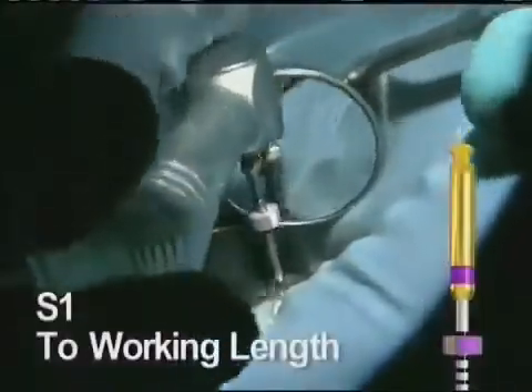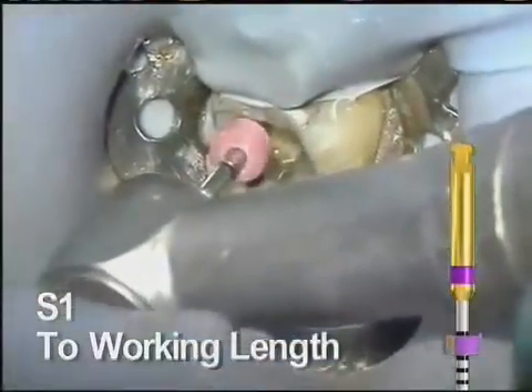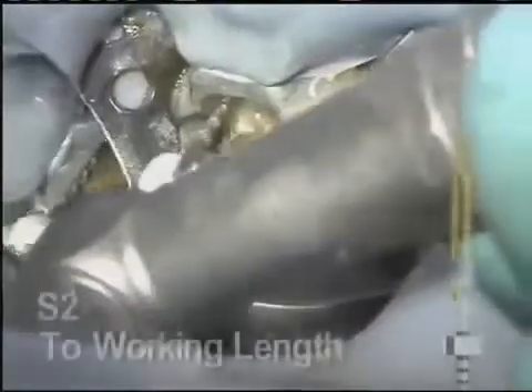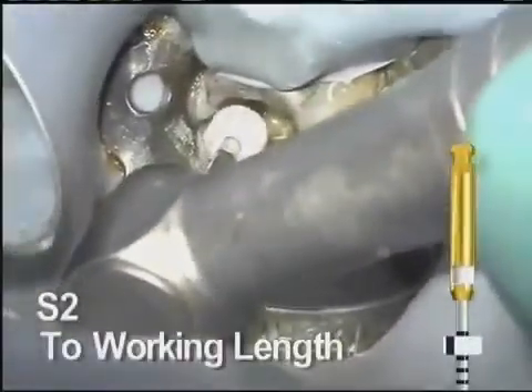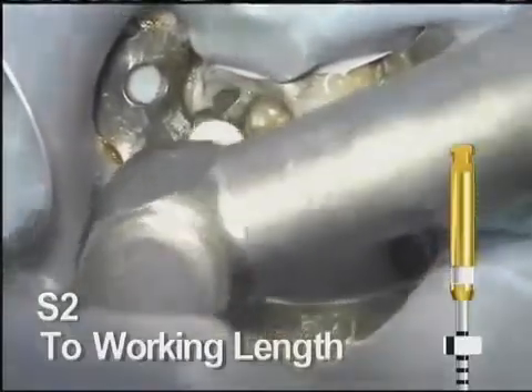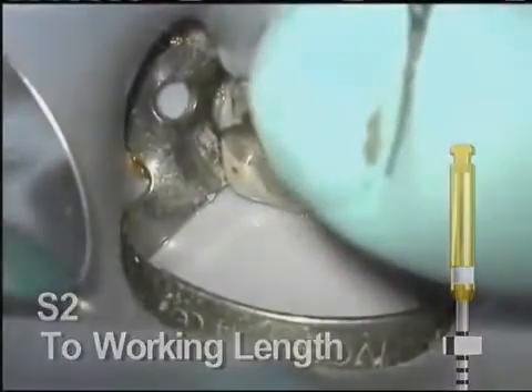These instruments create enough of a glide path to allow the ProTaper Universal instruments to comfortably shape the apical portion of the canal. S1 is reintroduced and is easily taken to length. Once it reaches working length, remove it. The S2 easily follows to length and the canal has a nice tapered shape throughout. Always remove, clean, and inspect every rotary instrument frequently throughout the procedure.